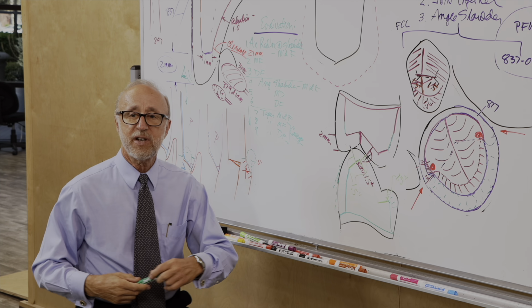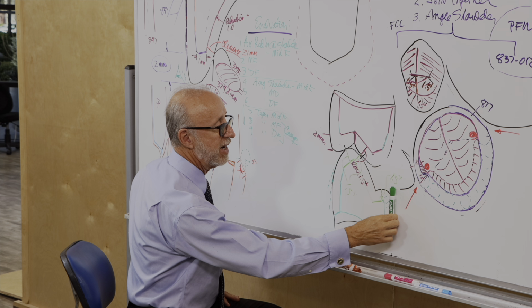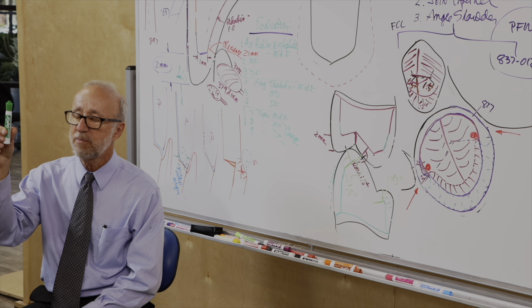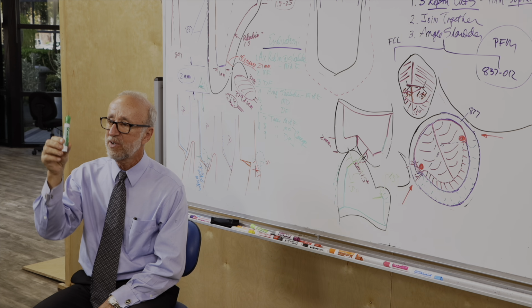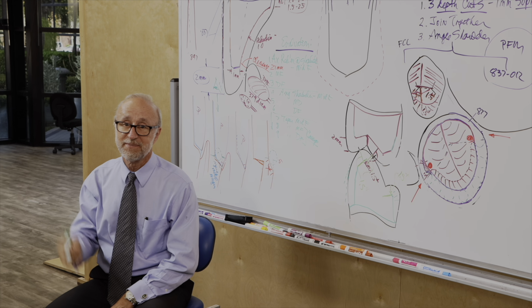We always do the secondary plane by taking the burr, putting it against the adjacent tooth at the level of the occlusal third, and seeing if there's anything to cut at that angle. Nothing to cut because we've already tapered that. Okay. So again, always check by comparing. Remember the cook and the chef? Yeah. So taste it. Right? So take your burr on the adjacent tooth, occlusal 1/3, see if there's anything to cut at that angle. If there is, then cut it. If there isn't, don't cut it. Okay?